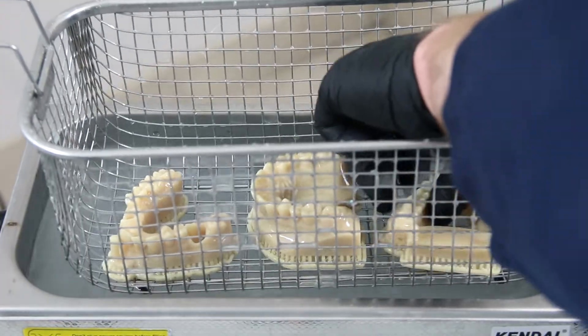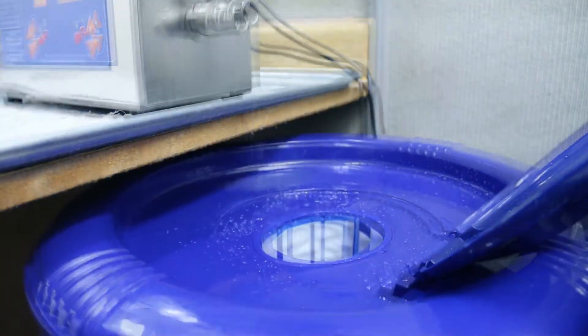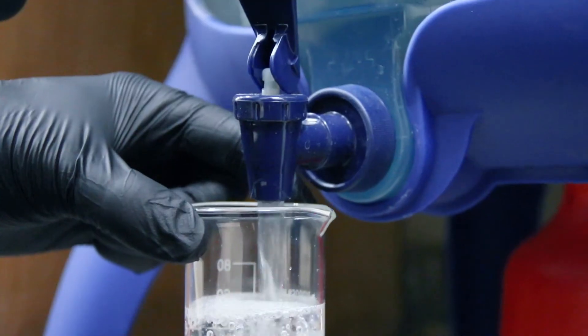The E-AQUO model delivers on our promise of providing the labs and clinicians with earth-friendly, non-hazardous solutions for digital dentistry.